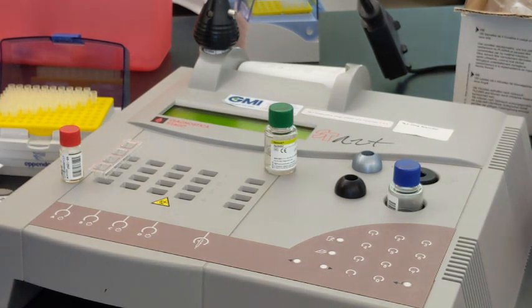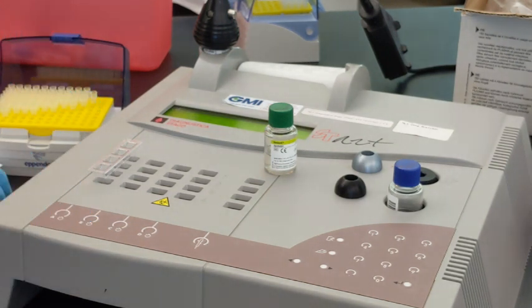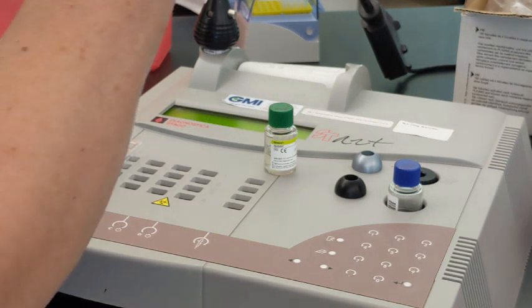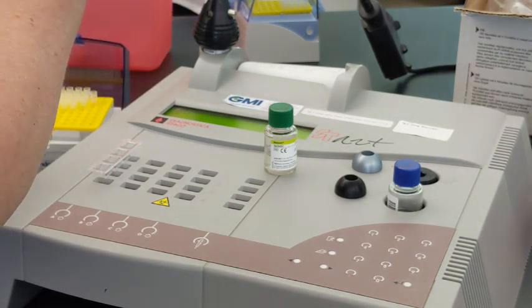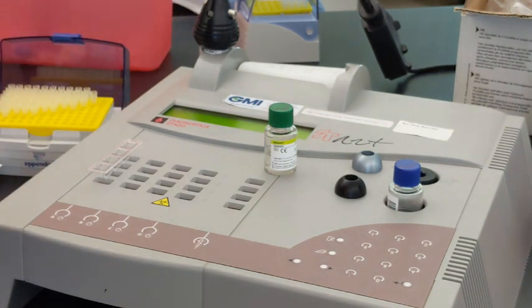Since I'm using a different sample, I'm going to go ahead and change my pipette tip to avoid any cross-contamination. So in wells number 3 and 4 of this particular row of cuvettes, I'm going to be adding the 7117 in spot number 3 and in spot number 4, changing my tip.